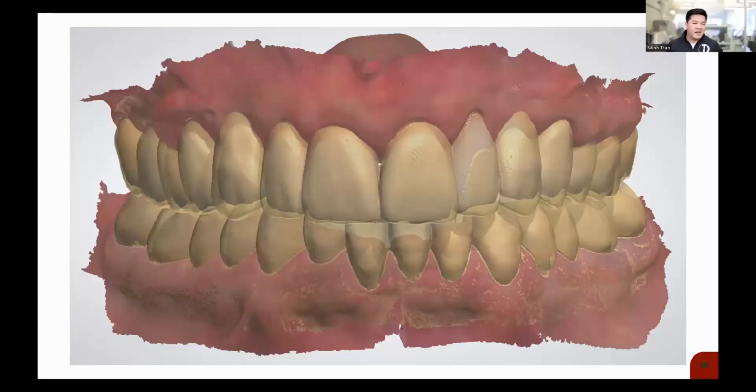If you're doing a fully additive case, that's a little bit easier. If it's a little bit subtractive, maybe you need to make a couple more models. But in terms of actually doing the diagnostic, at this point you're able to actually see the dentition, right? So you're able to see the function. You're able to take into account the actual spacing of the teeth. Often with just a 2D smile design, it's very arbitrary. You don't really see some of the stuff in the distal areas, in the posterior, in the lingual area. So now you're able to overlay some teeth. You're able to put it on there. And with this 3D diagnostic, you can also overlay those smile designs that you had approved from the patient.